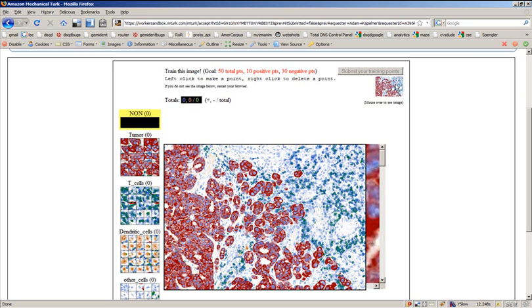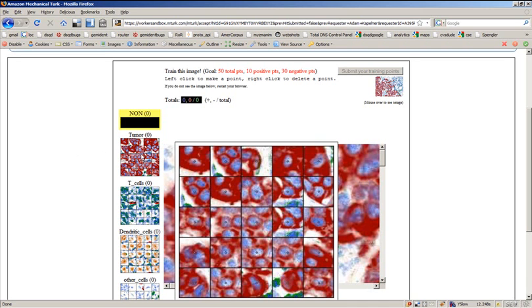Let's examine our phenotypes as a worker would initially do. So the tumor phenotype seems to me that we should place a dot in the center of blue circles surrounded by red. Let's do a couple of these.